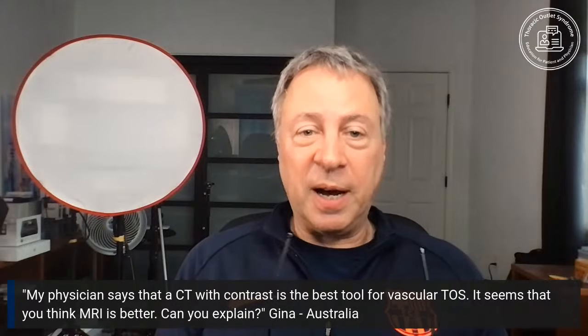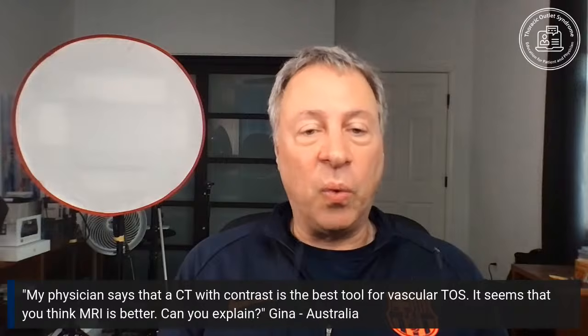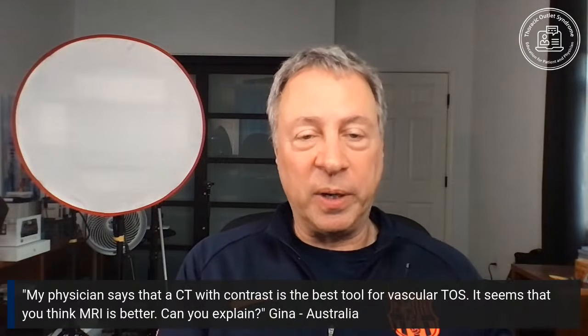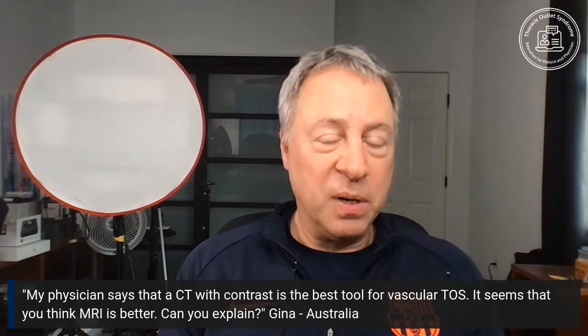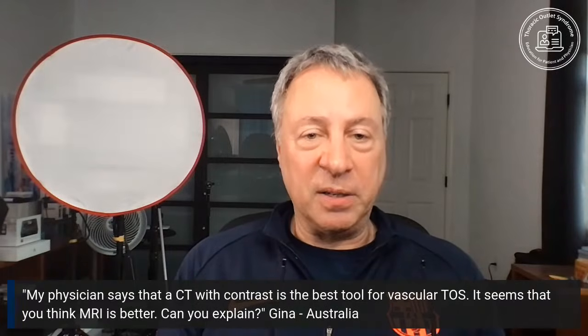But I do this all the time. So if I'm interpreting it, MRI for me, to look at one set of images, go back to the other one, is a piece of cake. It's what I do. And it does provide more image data in the end.